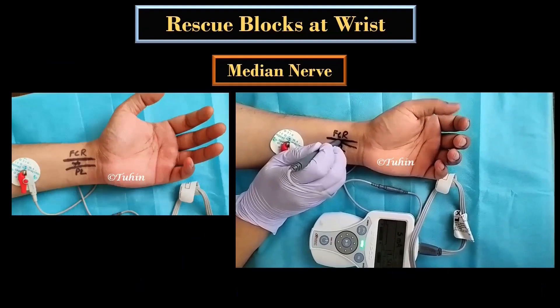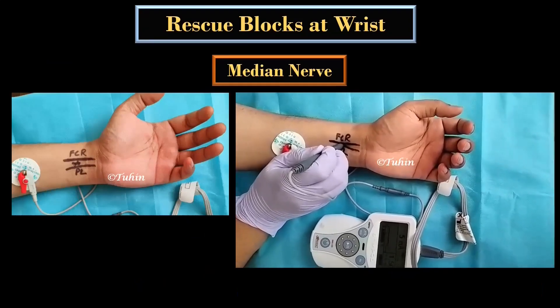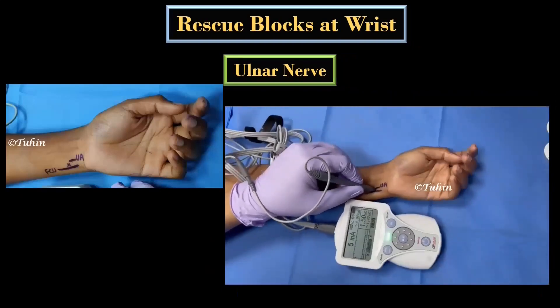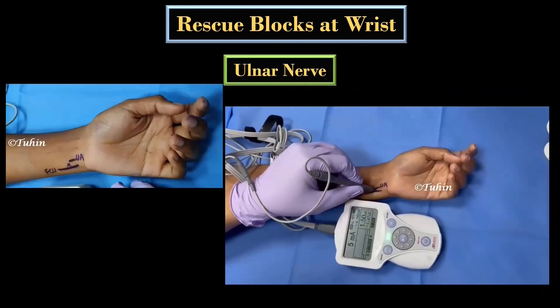At the wrist level, the median nerve is identified between the flexor carpi radialis and the palmaris longus tendon. You can ask the patient to flex the wrist against resistance to identify the tendons. For the ulnar nerve, the needle insertion point will be between the ulnar artery and the flexor carpi ulnaris tendon.